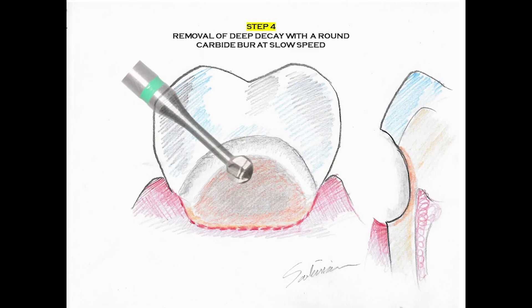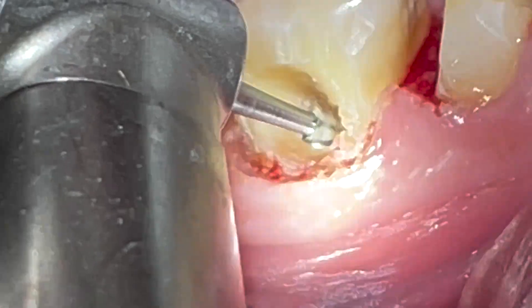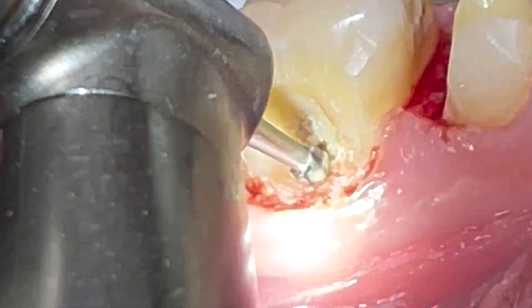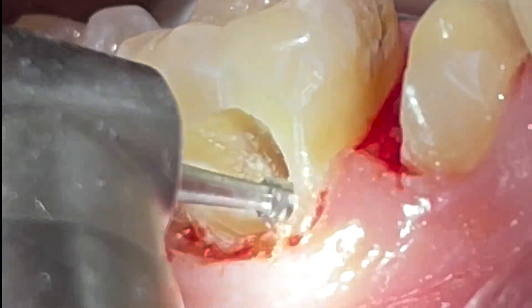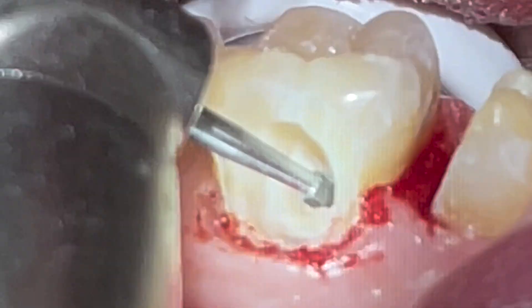After we have exposed all aspects of the cavity, both supragingival and subgingival, we now proceed with a very slow tungsten carbide round burr to scoop away decayed tooth structure, but still staying away from the very deep aspects of the cavity. We have to pay particular emphasis to that part of the dentin which extends into the undercuts of the dentino-enamel junction.